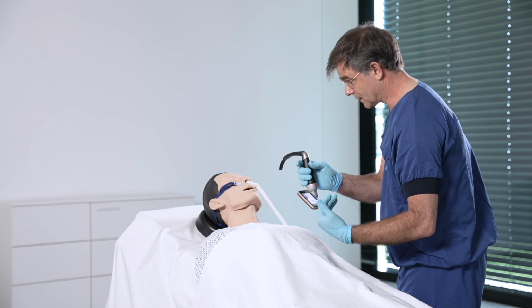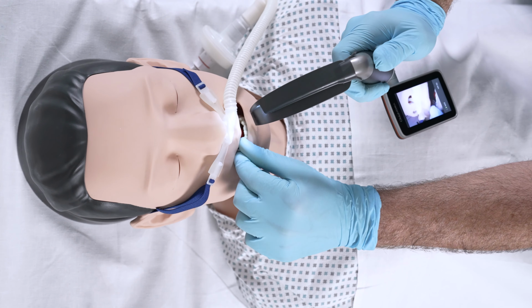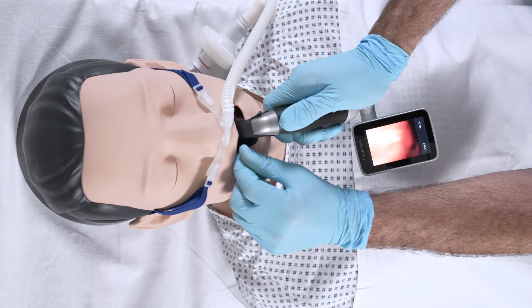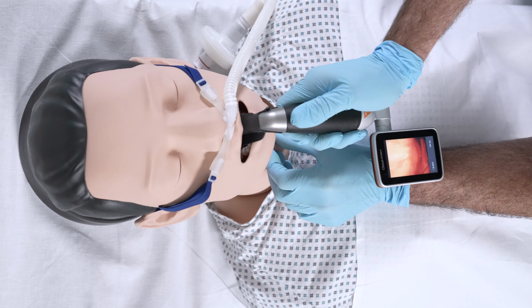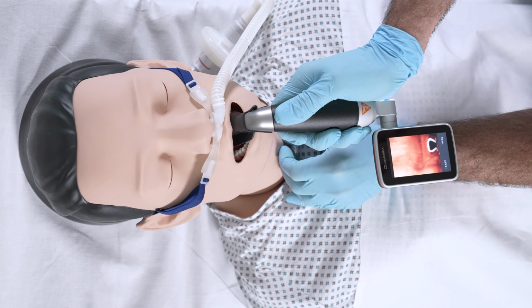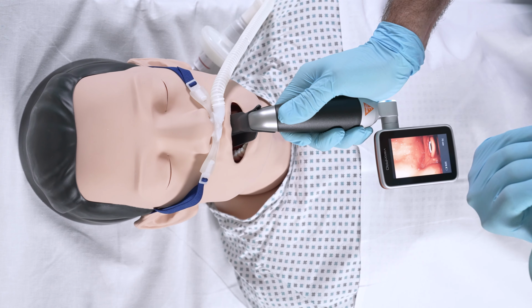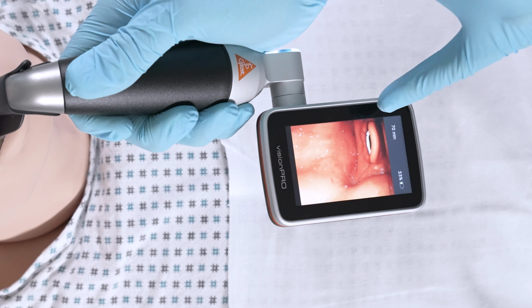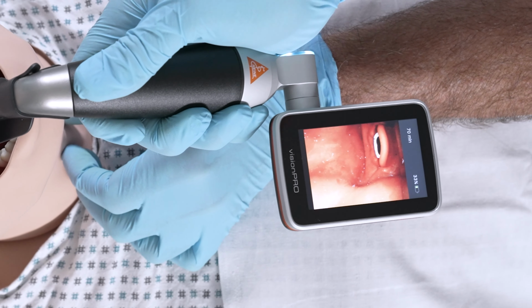So I'm on the left side of the patient. I will introduce the blade over the middle of the tongue. We'll try to get the best view and engage the vallecula. And here we see the vocal cords. The patient is awake, so I don't pull on the blade, and you can see the epiglottis. You can see the vocal cords. In a real patient they would move now because the patient is awake.